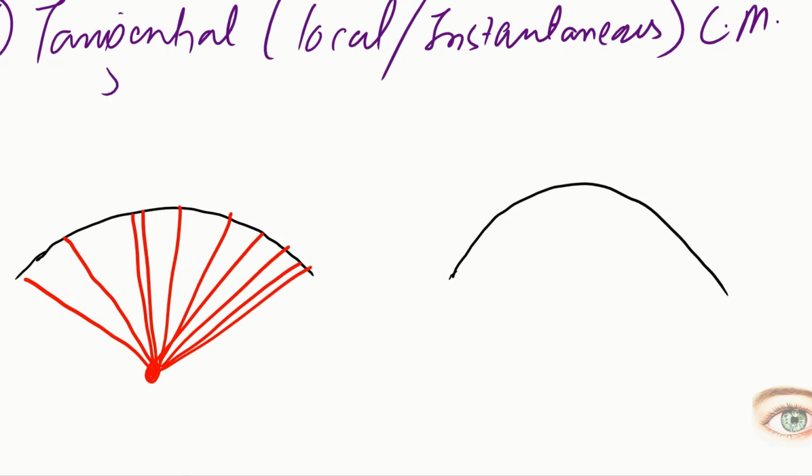So with the help of this, it is going to make a reference image, reference line, and this is the patient's cornea, which is like this. The axial curvature map assumes the reference is a perfect sphere, and our cornea is not a perfect sphere. It actually flattens towards the periphery, and it is slightly steeper in the center.